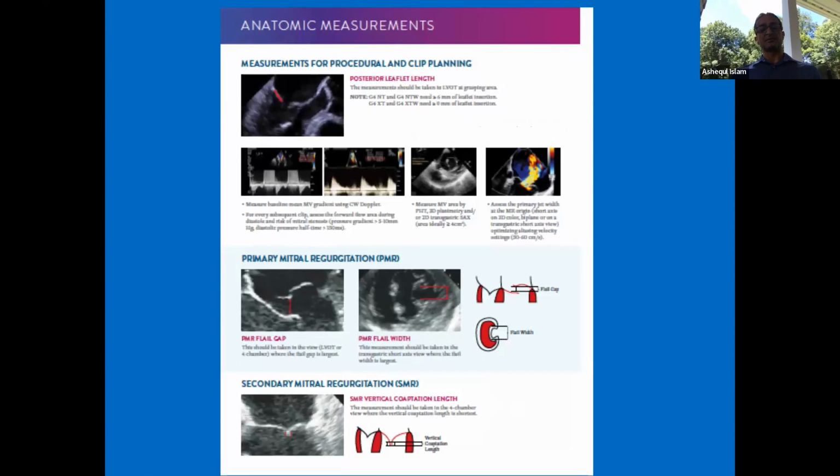There are a few other things you have to consider. Not all valve pathologies are easy to treat, depending on, we have two different lengths of MitraClip these days. MitraClip started with the NT device, which was the only device available for a while. And then they came up with the XT device, which is a wide and long device. So you have two different types of MitraClip. One is the narrow, which is N. One is the wide, which is, sorry, N is the shorter shoulder.